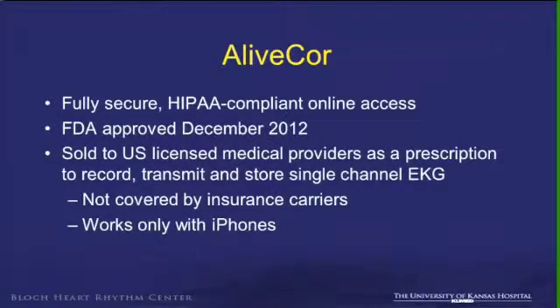These particular devices are sold in the United States to licensed medical prescribers as a prescription to record, transmit, and store single-channel ECGs. Not currently covered by insurance carriers. I believe the cost is $200 for these patients to obtain them after they get a prescription from their medical providers, and currently it works with the iPhone, I believe 4 and 4S, but not 5 as of yet.